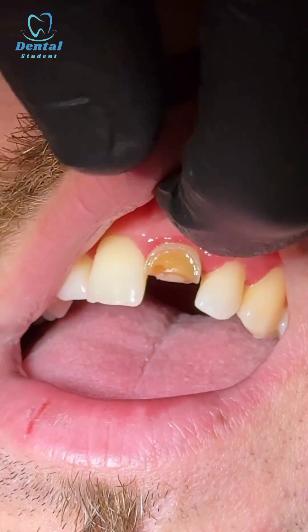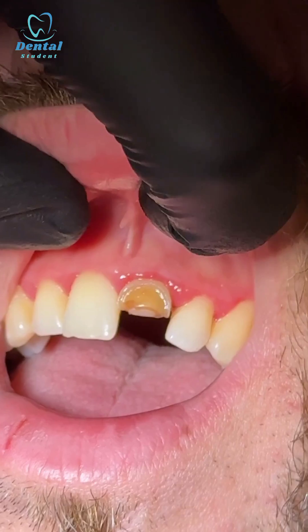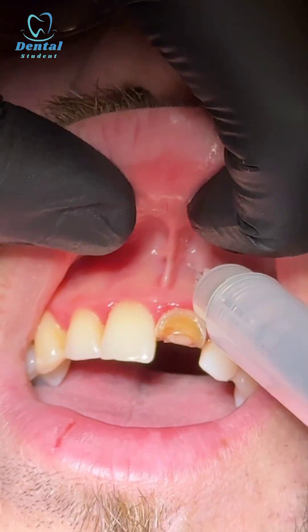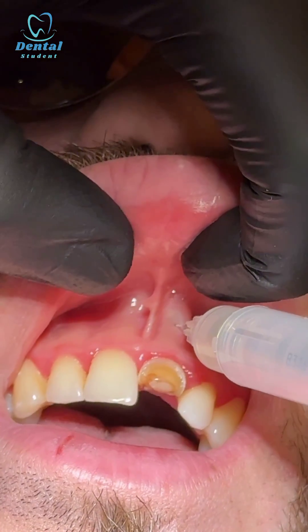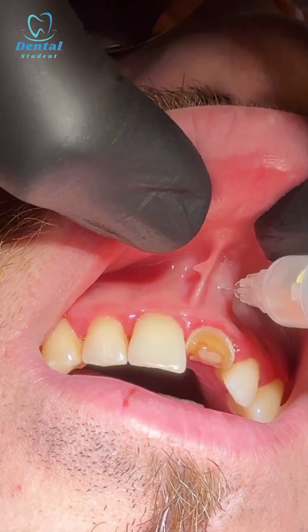For the upper left one, you need to numb up the anterior superior alveolar nerve. You go at 45 degrees to the tooth, toward the apex of the tooth. Sharp scratch — you gently, slowly inject. 45 degrees — note the angulation to the tooth.